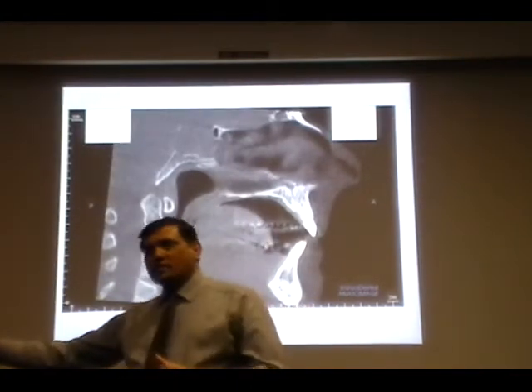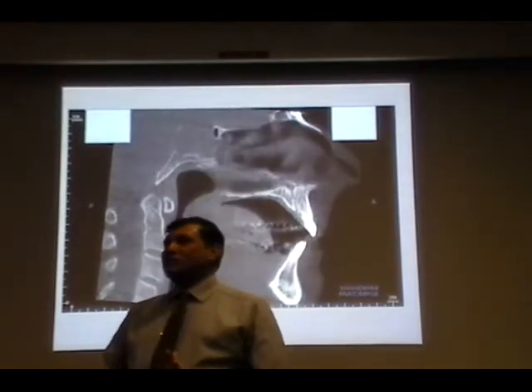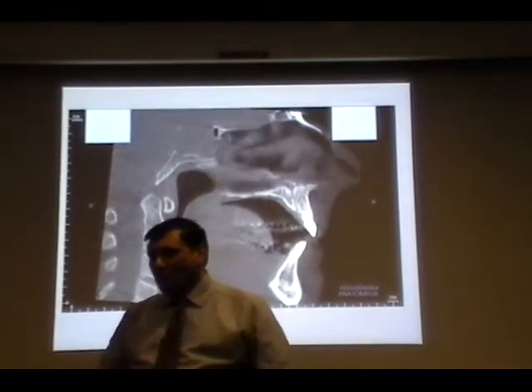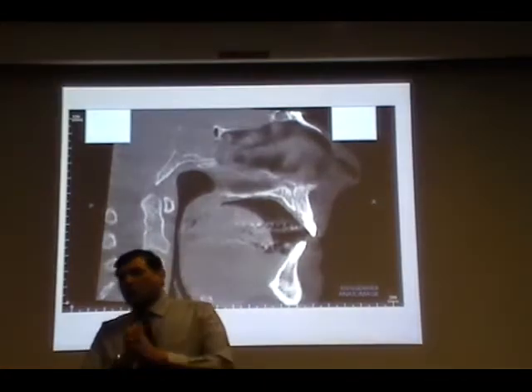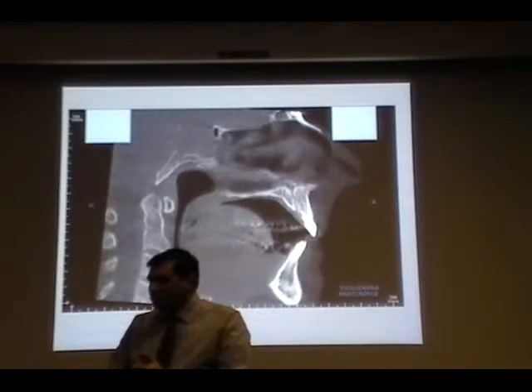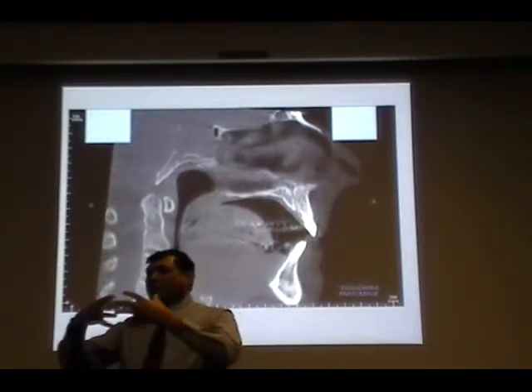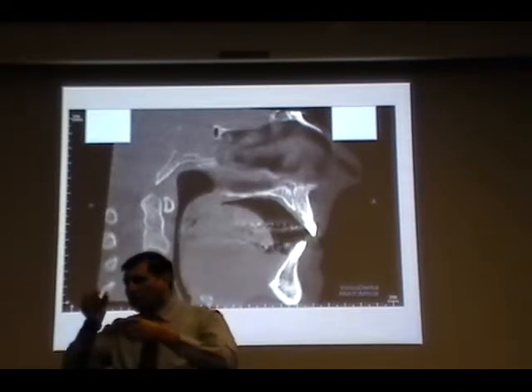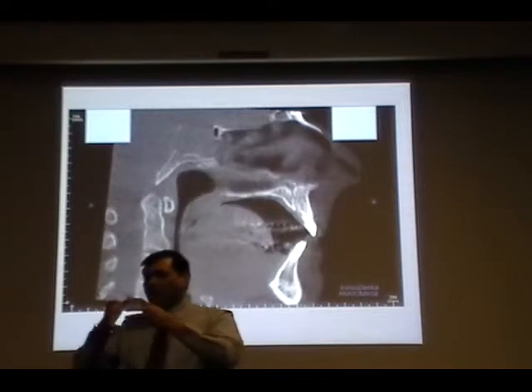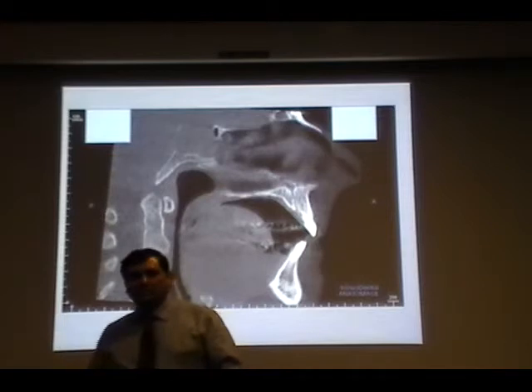If I teach that, everybody will fall asleep here. So let's pretend we are not going to talk about that at this point. Computers will work behind the screens, so you can look only at what you want to see, depending on the slice. Slice is a part of volume. Imagine this is the whole volume, but if you want to look at only one part, you can still see. What I've done is, out of this whole thing, I took one slice and put it here. Make sense?